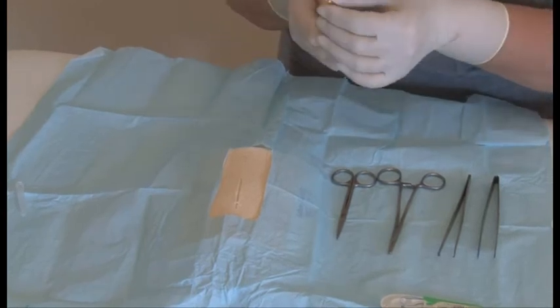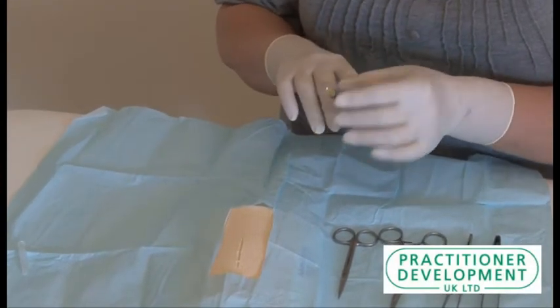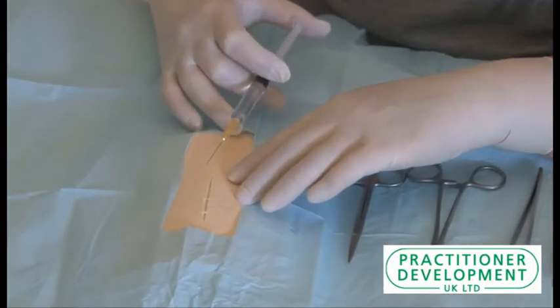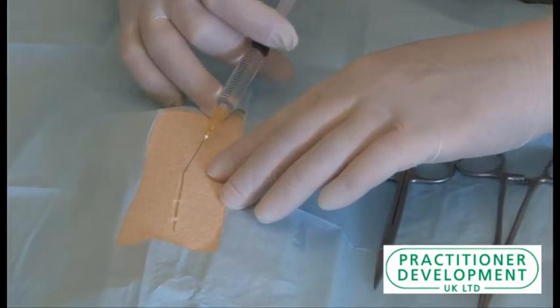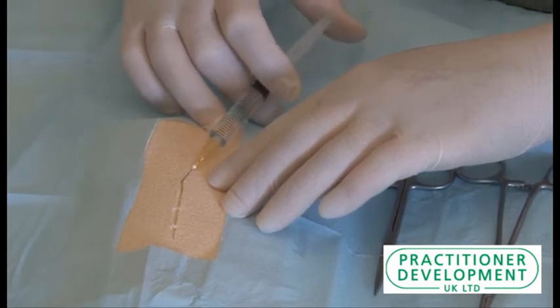We would do this with lidocaine 1%, and I'm going to use an orange needle because this gives us the finest amount of liquid into the wound. I'm going to start at this end, go into the wound at about a 45 degree angle.